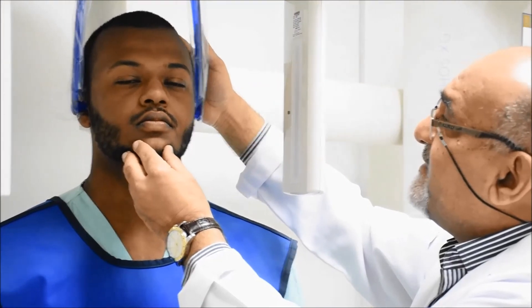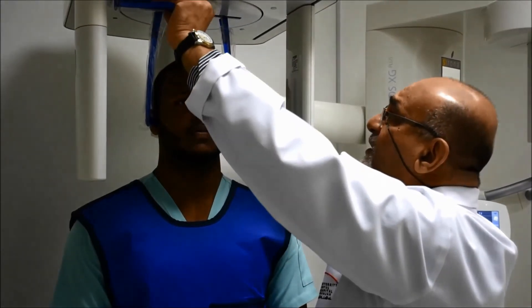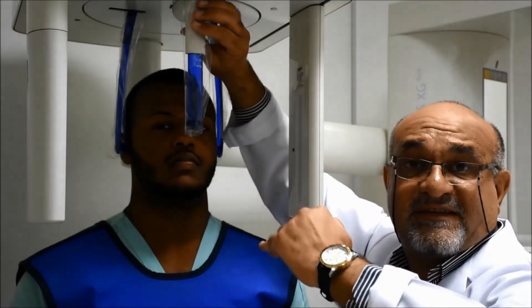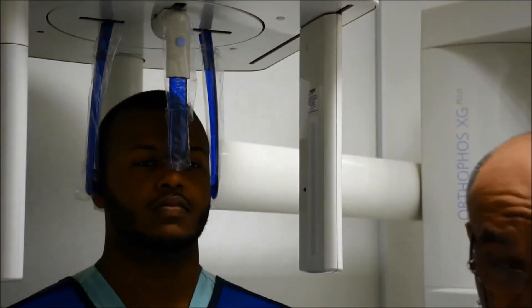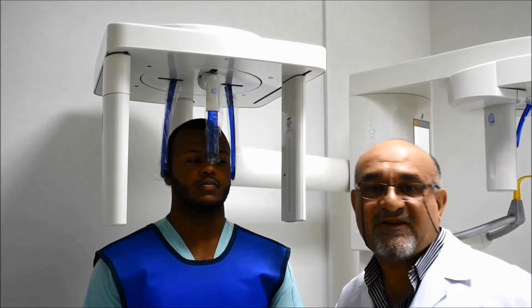The Frankfurt plane should be parallel to the floor — this is very important in the lateral ceph. To ensure this, use the frontal stop. The frontal stop moves forward and backward to accommodate the patient's head, then you bring it down so it sits at the frontal-nasal suture, adjusted in height from the nose. This positions the patient so the skull does not move up or down.